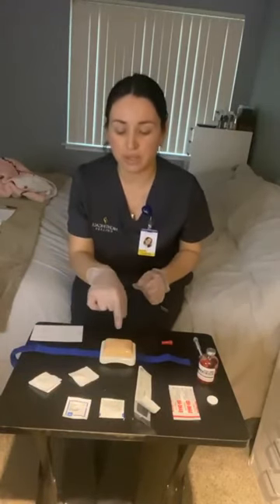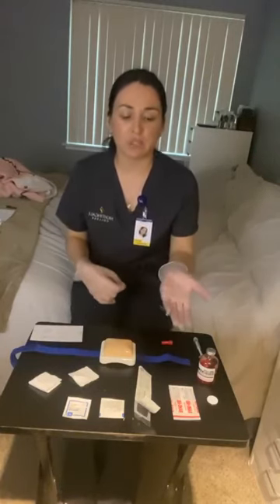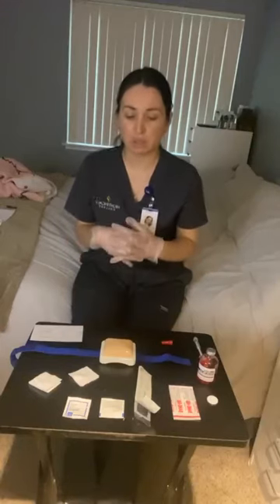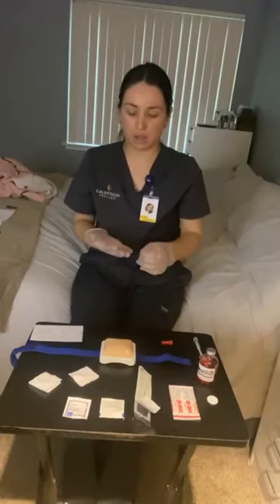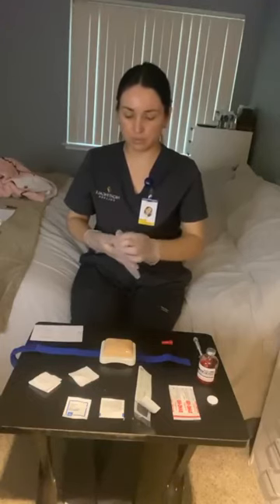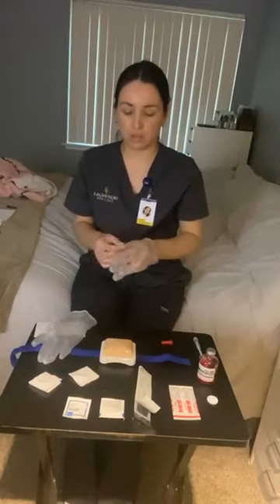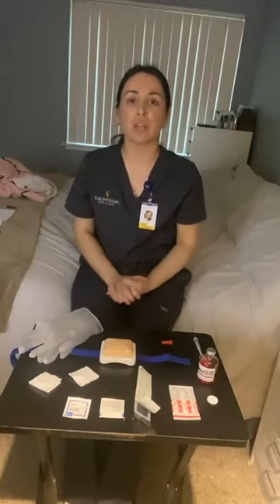I would get a new alcohol swab and place it in the center, working outwards about 2 inches. I would place a band-aid if necessary. Make sure they're not allergic to any adhesive bandages. I would remove my gloves, place them in the trash, perform hand hygiene, and document what I did.